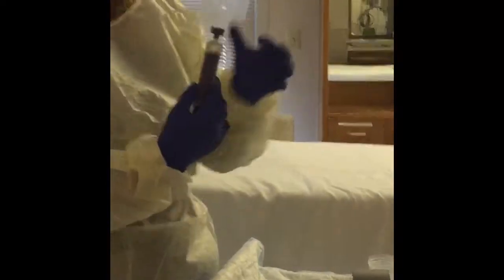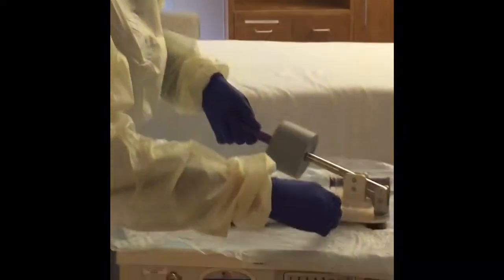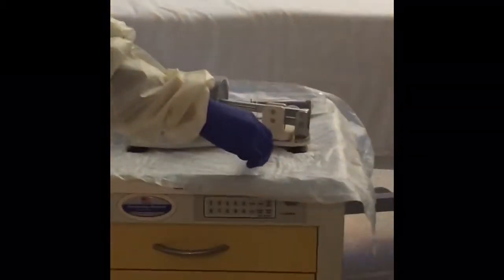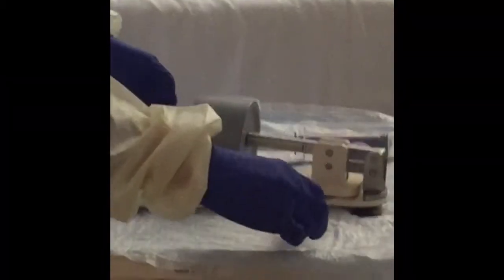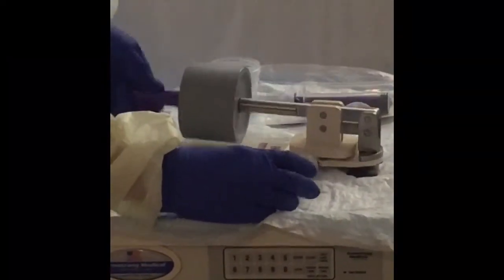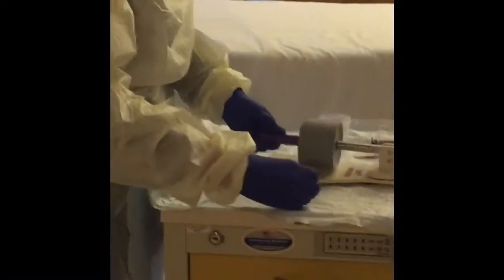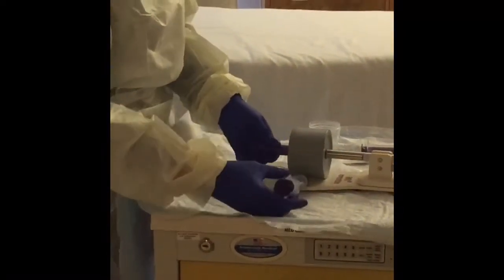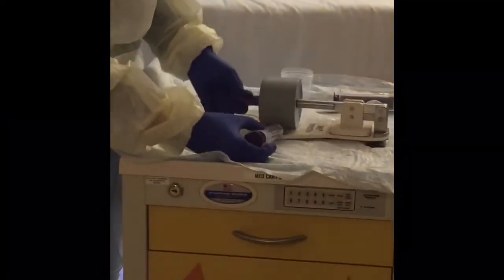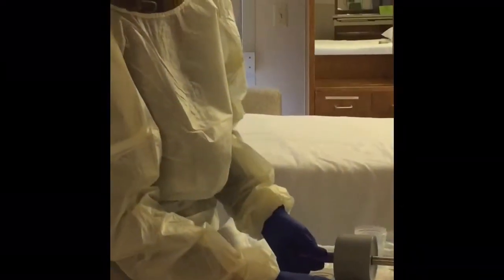Now I'm going to take the pill pack with the pill and put it under the crush plate, and I'm going to move the handle up and down to crush it. You can see that crushed it pretty well right there. And now to pulverize it, I'm going to use the pill roller. So that's just like this. And I'm just going to go over it until I feel like that pill is completely pulverized.